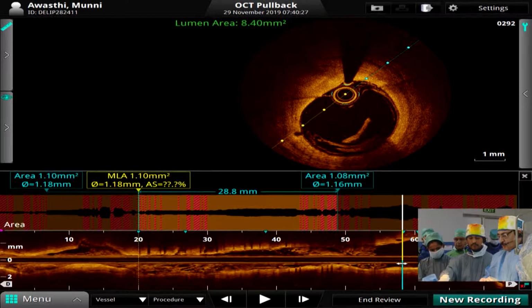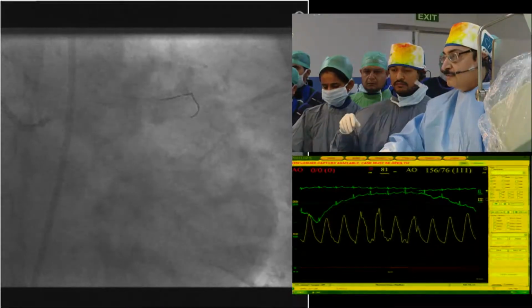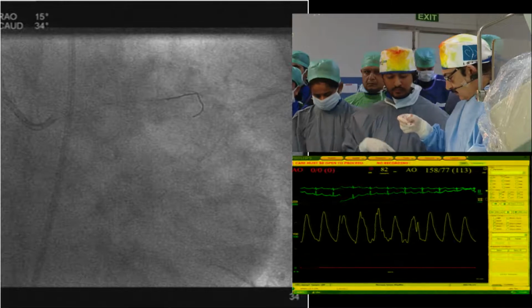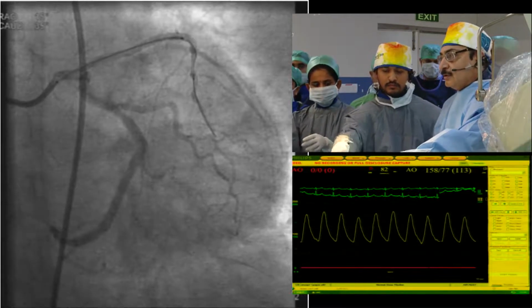Okay. Now, can I go to the runs of today? Can you just show the first and don't pull on this. Somebody's pulling on this. Okay.